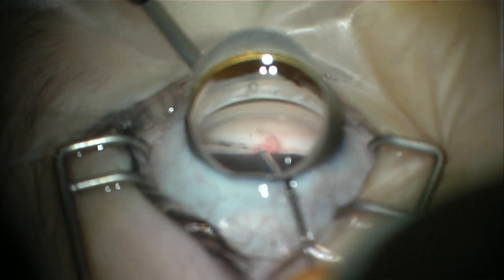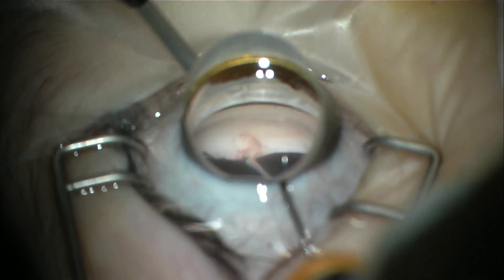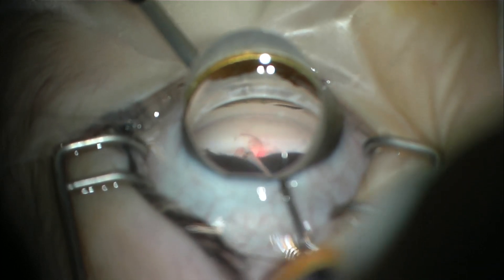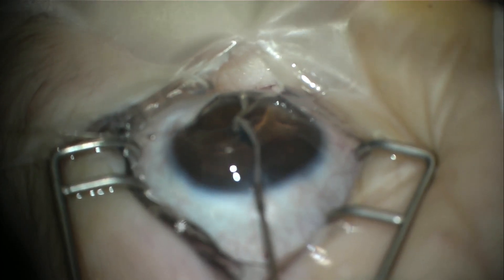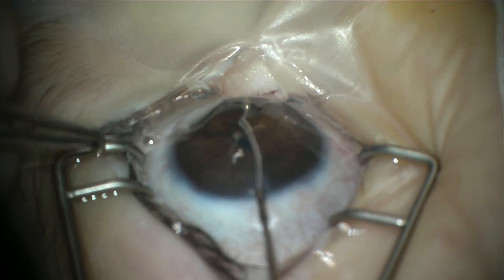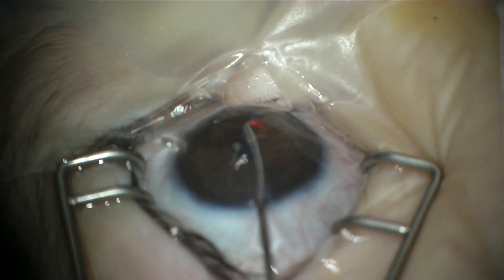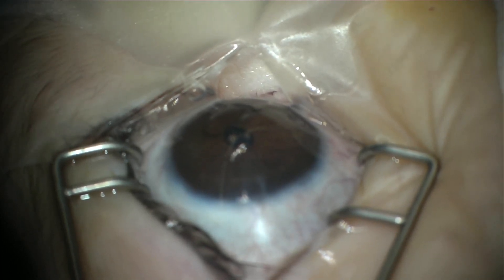And here it comes. Once it's back around, the forceps are used to grasp the lighted end, and the lasso will be pulled by placing force on both ends of the catheter, which will pull it through the trabecular meshwork — and here it goes across, so that we have just opened 360 degrees.